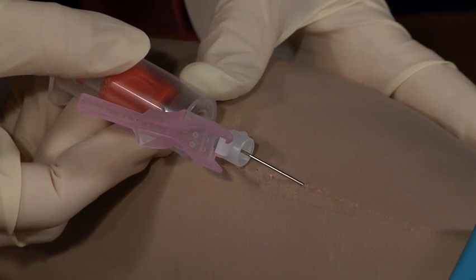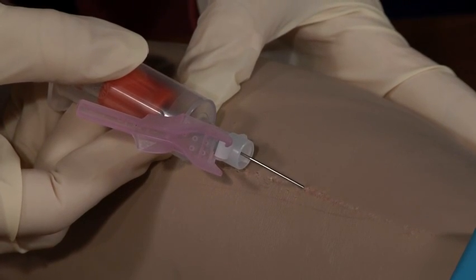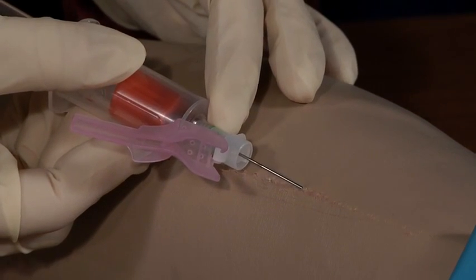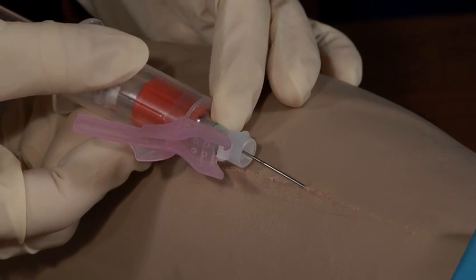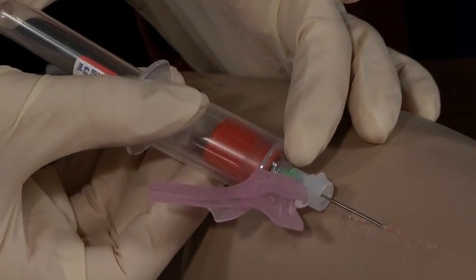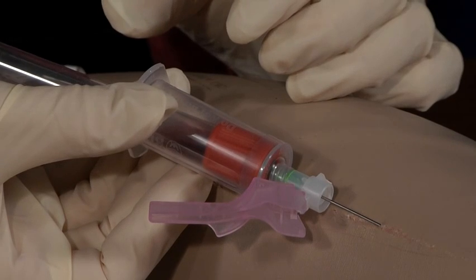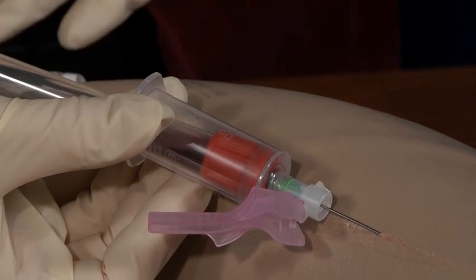It's a little bit more difficult than initiating an IV because there's no flash. But you'll feel a pop when you get into the vein. Don't go any further. You'll go through the wall. The next thing you want to do is activate, I say, this tube by pushing it all the way forward. Now you can see that there's blood coming into the tube. You'll allow the blood to come in until there's no more. There's no more vacuum in the tube.